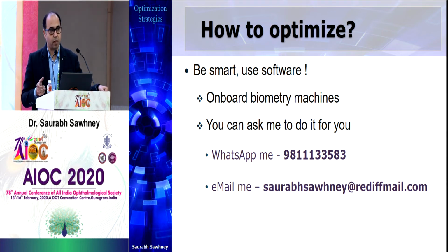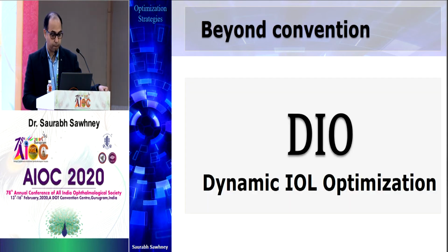And once you have done that, once you have optimized the constants individually for each formula, you will find that the differences that emerge in the formulas, like I showed you in the beginning, start to disappear. So even across the ranges, the formulas now start to predict much more closely placed values than before. So that is a definite benefit you will get.